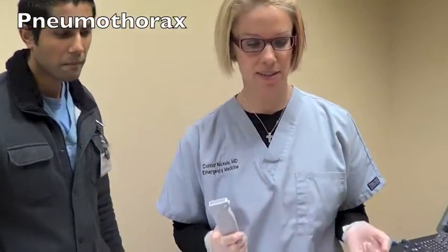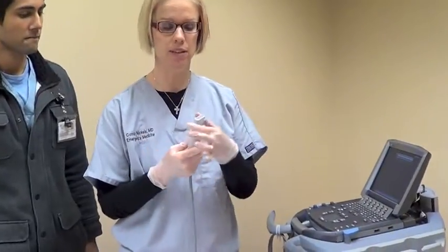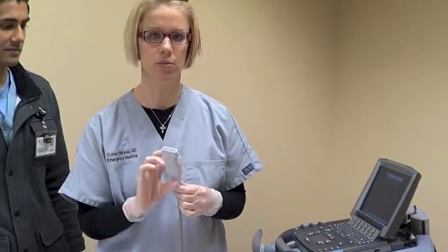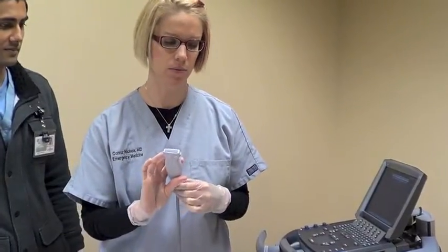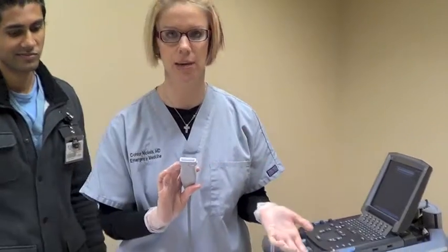Pneumothorax — you can do it as a separate exam, or you can do it as part of the FAST, called the E-FAST or extended FAST, which means we're looking at the lungs as part of that. We usually use our linear probe. This is the smaller linear one, but you can use the larger linear one as well. We're not going very deep, so this is the highest resolution probe for the depth that we're going.